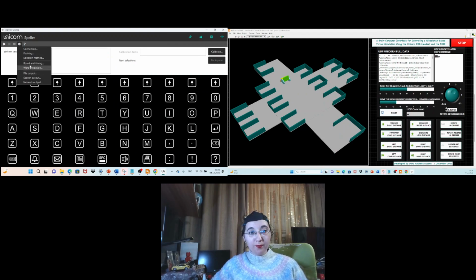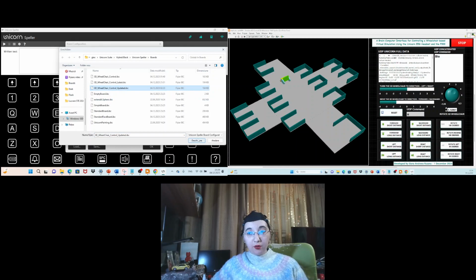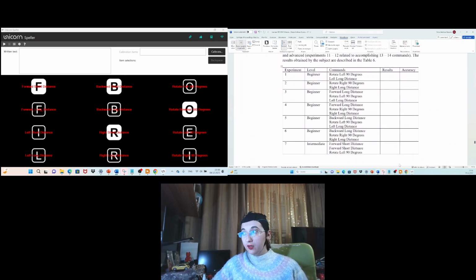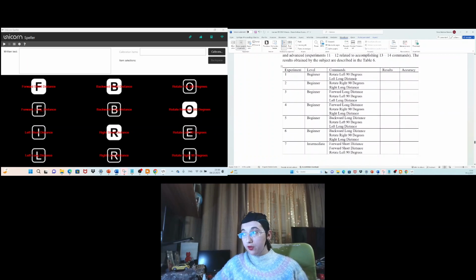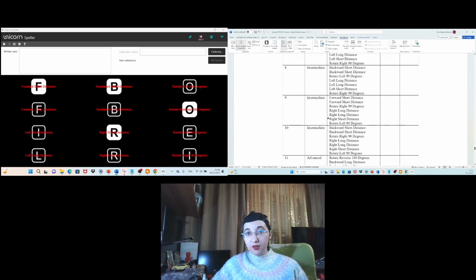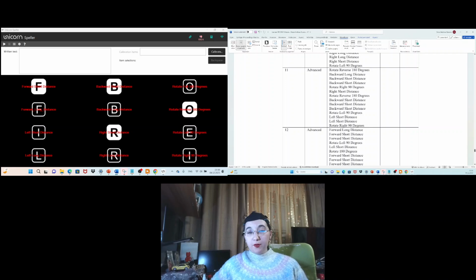And now I will open the board that I customized for the current purpose of simulating the control of the 3D wheelchair. And the commands that I will send are explained here. So beginner level, intermediate level, and advanced level. Beginner level supposes to send 2 and 3 commands. There are 6 experiments. Then intermediate level is related to sending 7 commands, and it is based on 4 experiments. And finally, the advanced level is related to sending 13 or 14 commands, and this means to perform 2 experiments.